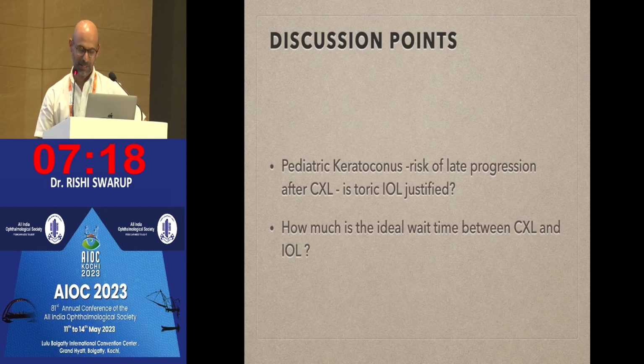But generally, waiting for 12 months, should we consider under-correcting or doing something else? So yes, all those thoughts are there, and there's no perfect answer. I was looking more at making the patient emmetropic, and we can always treat. If you raise the repeatability of the biometry by 1, and instead of 2, you take the benchmark to be 3, and all the 3 biometries have stayed stable, then perhaps there's no reason why we should tweak the correction. It can be an optimal correction as well. Yeah.